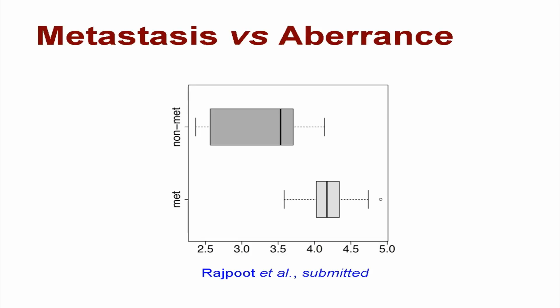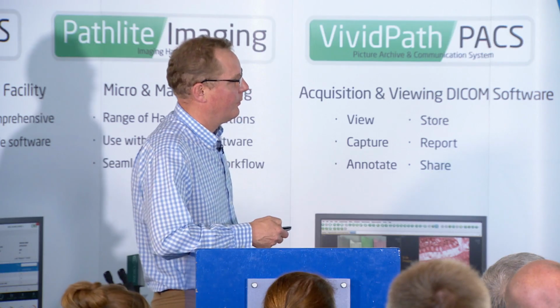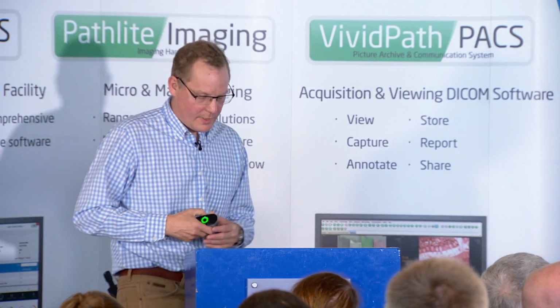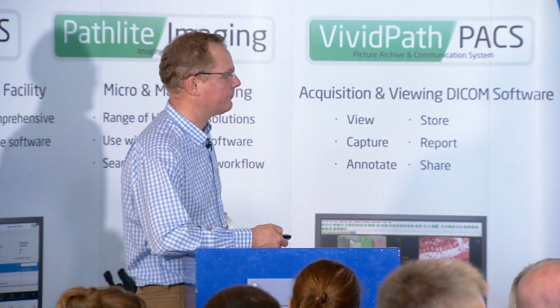And likewise, the degree of aberrance from an ellipse that the predominant tubule formation is showing is also coding for metastasis in this group of patients, as summarised in this table here. So this is still early work on these cases, but we think we're making some progress in whole slide imaging and deep learning in providing some tools which will help with predicting metastasis in the future.